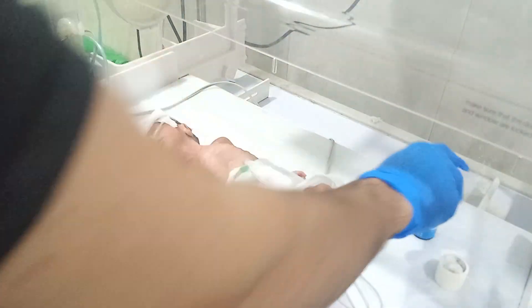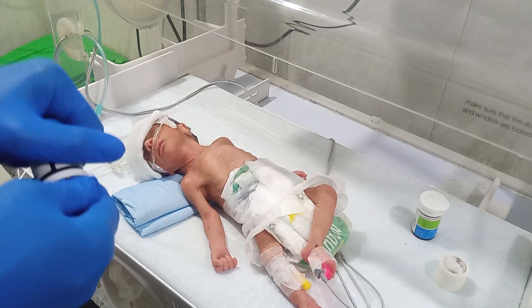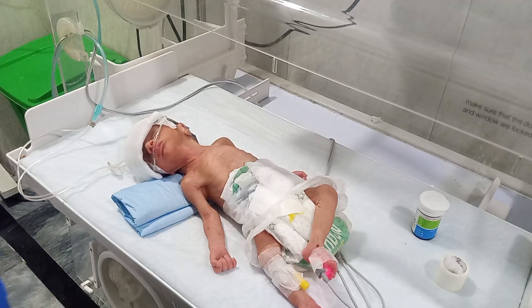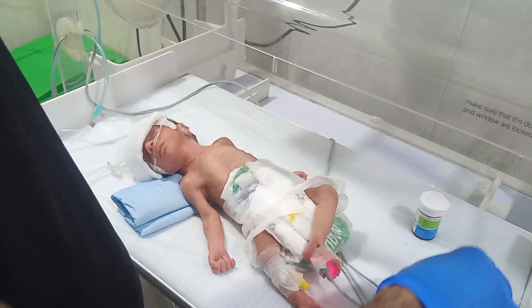We are going to check the RBS of the baby. RBS of the preterm baby is very, very important — sometimes the baby's RBS falls very quickly and they don't recover again.